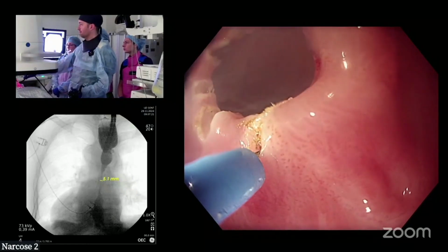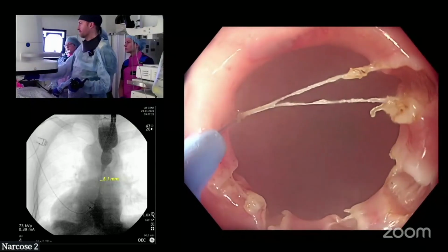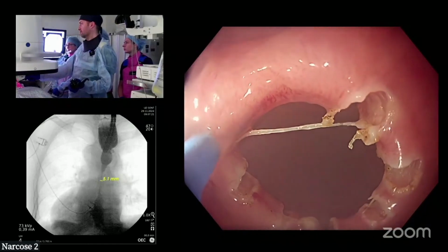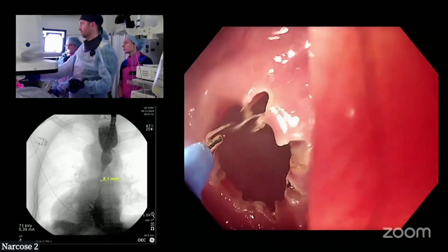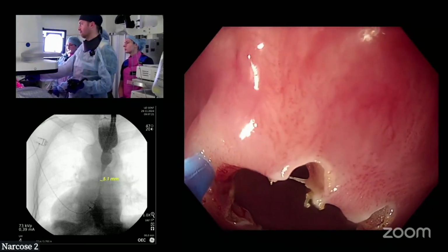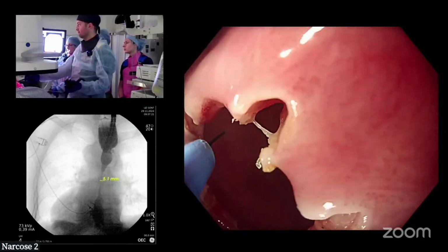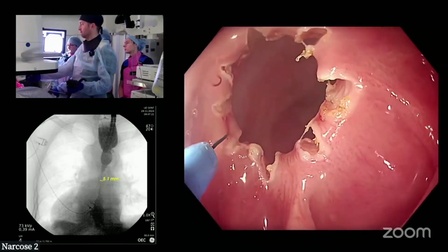Seminar room? Now's your chance to ask questions. Yeah, one question, David. Other than the general safety measures that you just outlined before actually doing the incisional therapy, is this something that is relatively safe to do in those patients in this setting, or is this something that should be reserved only for the most severe cases?